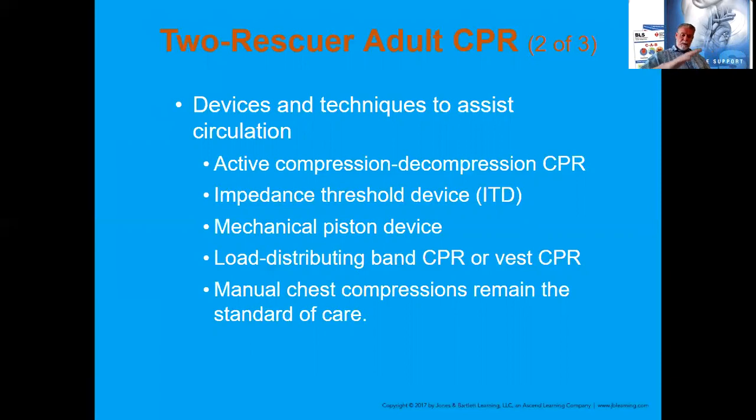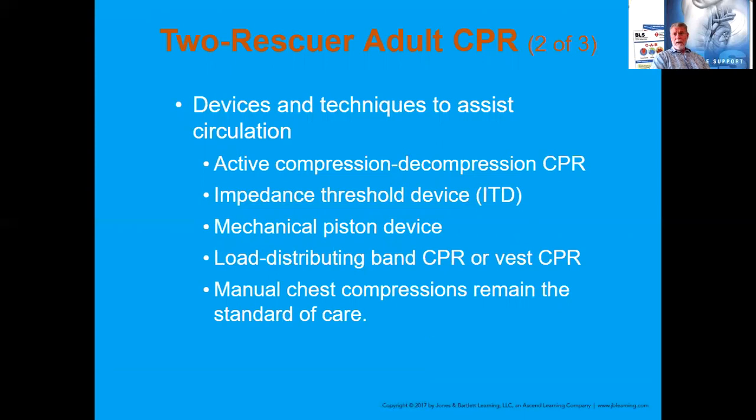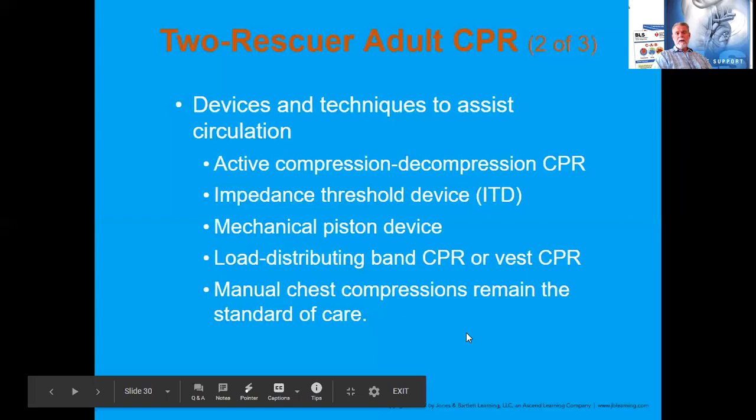These are mechanical. They compress on the chest at that 100 to 120 rate. There's vests or bands that are out there. I have not seen a lot of these since probably a 2010 EMS Expo. I think they're pretty expensive. It may be best where you have a code 10 or a code 20 truck, which just means there's one or two people going out on the rig and they need the CPR done so others can provide ventilations. Oh yeah, and then one person still has to drive you into the hospital. So it's still good compressions cannot be, you know, replaced.